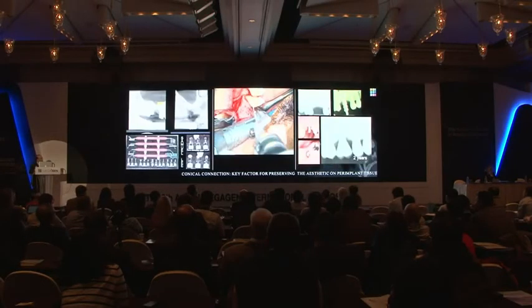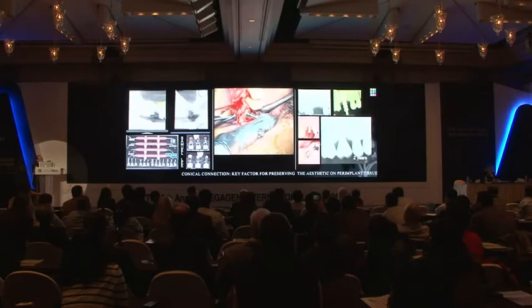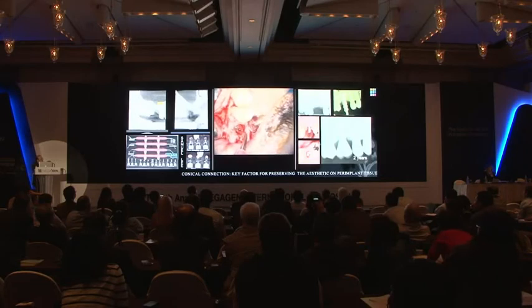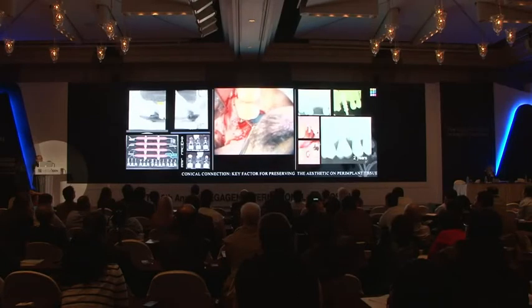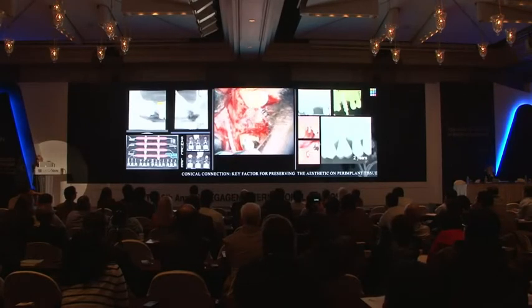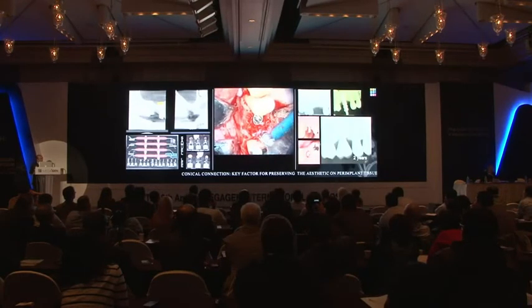But I wish to go back and talk again and in more detail about the Samuel Lee sinus lift kit, a really smart kit in which we have a soft approach to the sinus floor and to the sinus membrane. With these suitable elevators, we raise the membrane and we insert a certain amount of biomaterial and then the implant. And you can see the control after 2 years of loading.